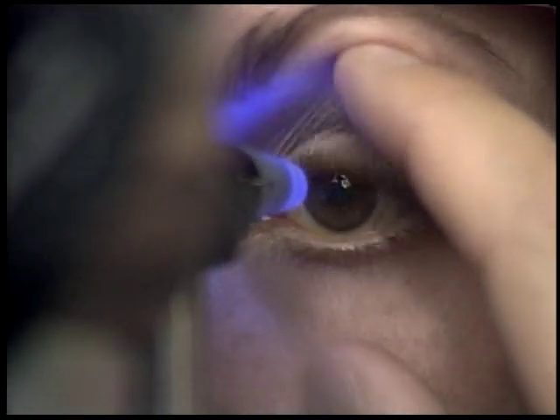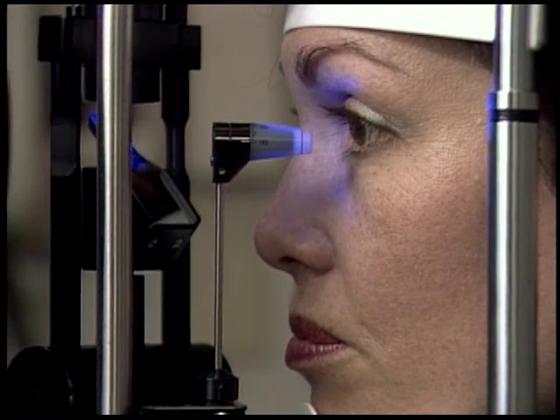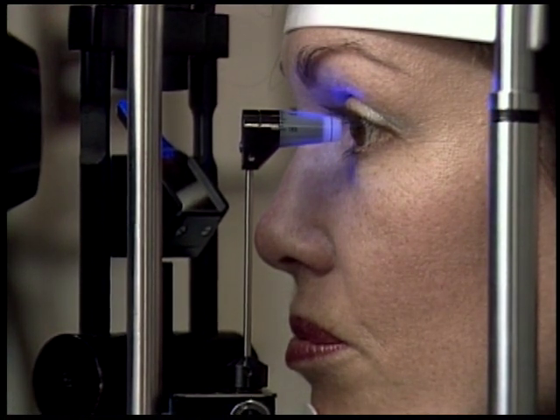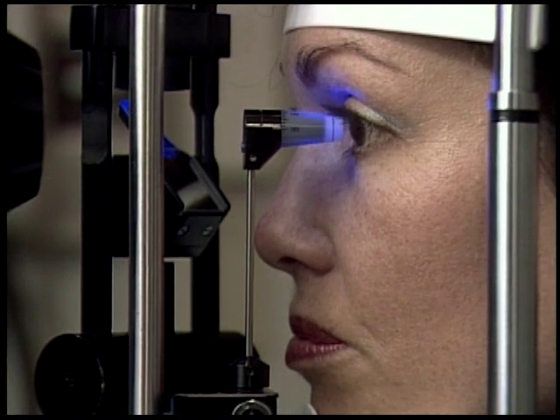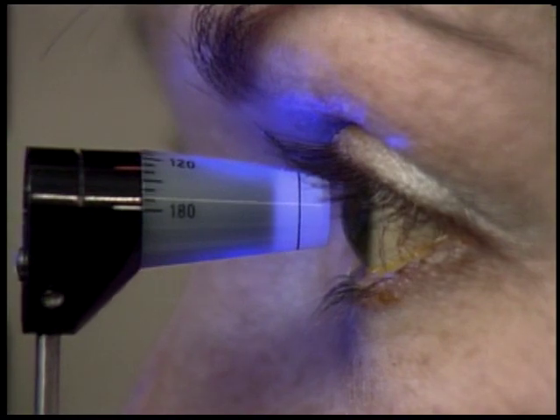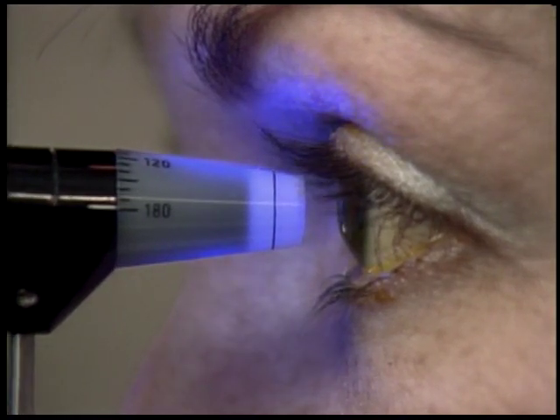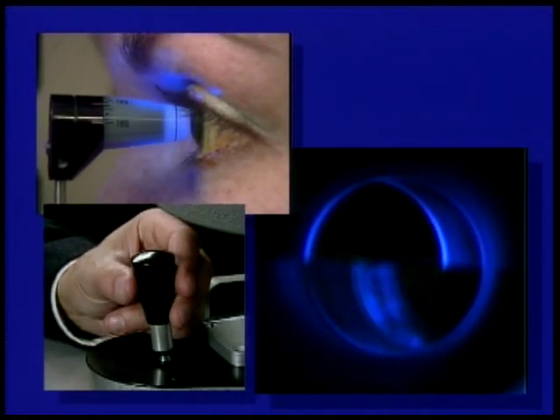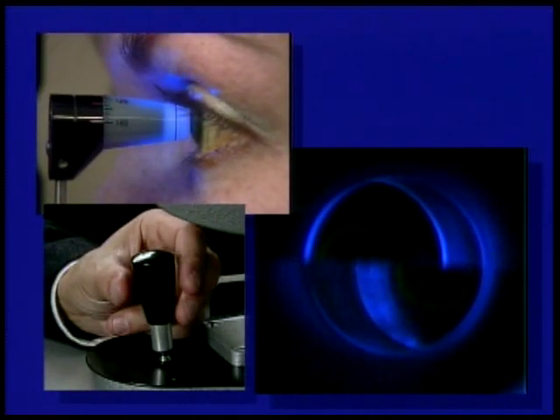not the globe. The slit lamp is moved to approach the cornea along the optical axis. The initial position should be slightly inferior to the visual axis, to slip under the eyelashes of the upper lid without touching them. The tonometer is then raised until the prism is centered on the cornea and gently brought forward with the joystick of the slit lamp.